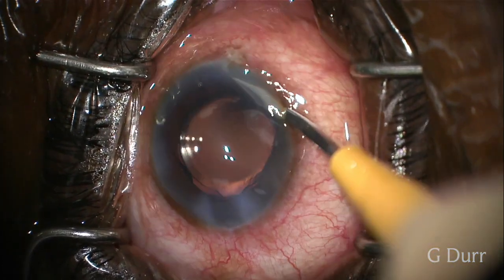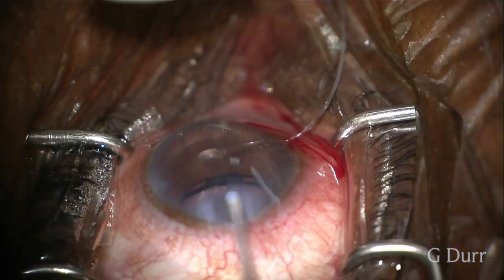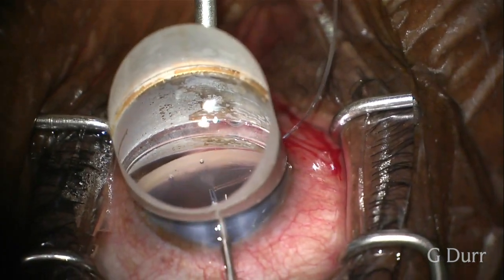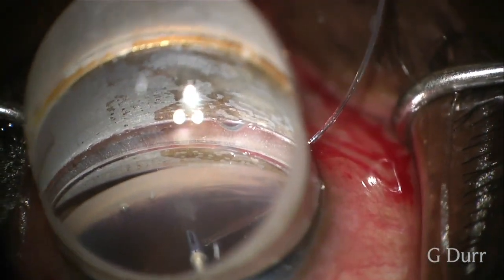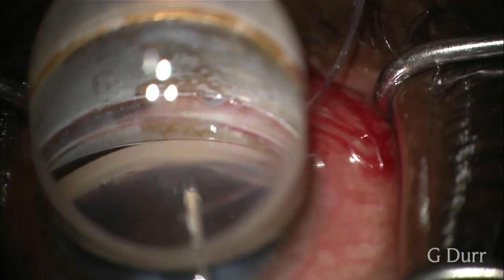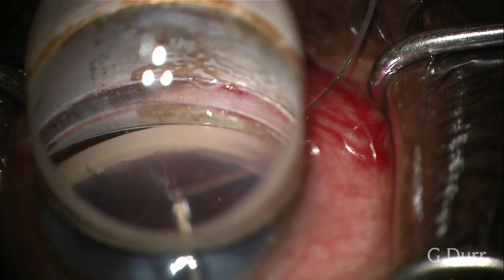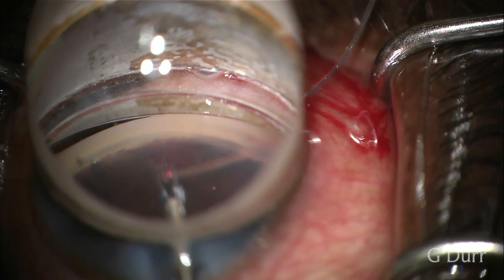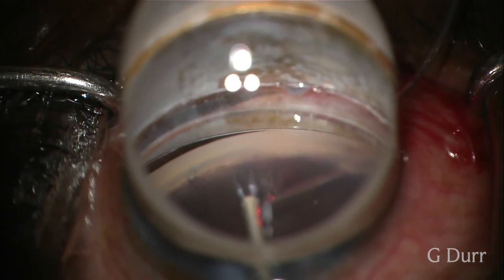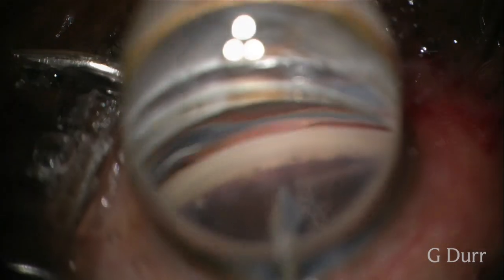And so we proceeded first off with the cataract surgery, and then we're going to release here the PAS that is focal at the area of the previous iridotomy. We're going to use the eye track here to also do some viscodilation at the time of insertion of the probe. And we're seeing here that the iris is very friable, and we're just slowly teasing it away from the trabecular meshwork. And we see how much pigment there is in this angle here, with a significant Sampaolesi line.